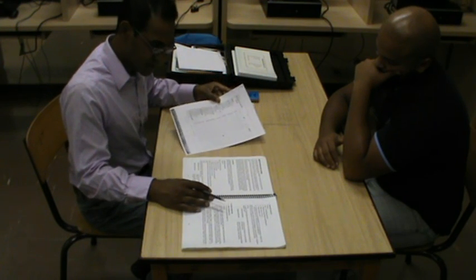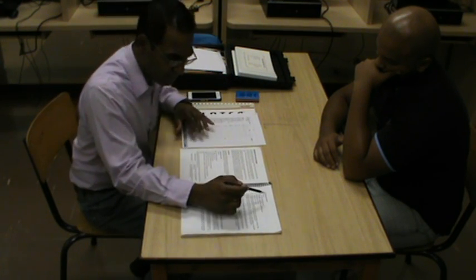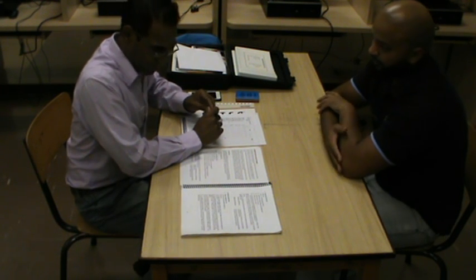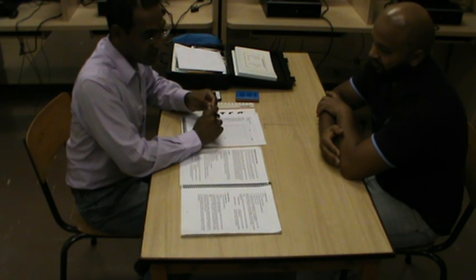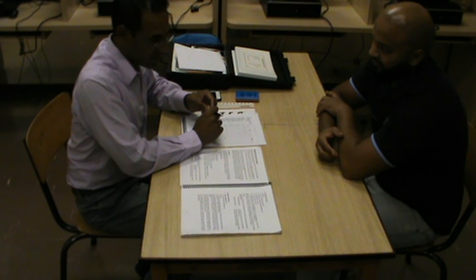It's usually very valuable afterwards when you're writing up your work assessment report. Okay, let's move on to the next part, orientation to time. The examiner asks the client the following questions. What day is it today? Tuesday. Good. What month are we in? January. What year? 2017. What season is it now? Summer. What is the hour now? What time do you think it's now? 12 o'clock. Okay. How long have you been in the hospital?